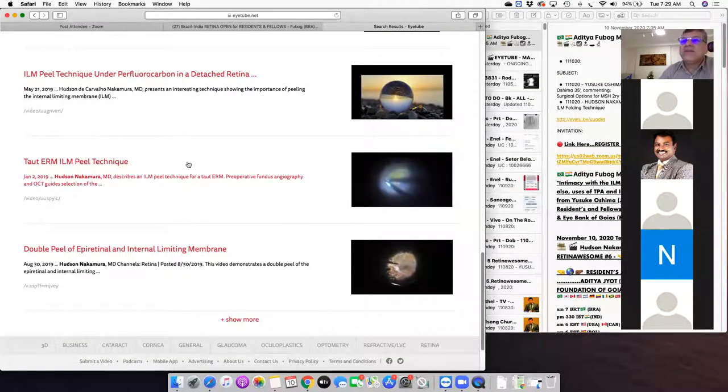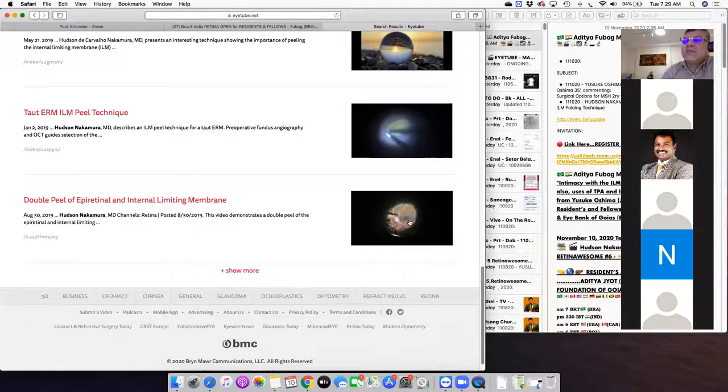If you have a very tough epiretinal membrane, how can you remove it without damaging the retina? This is another case — a double peel for diabetic patients. Some diabetic patients have had laser and have intrinsic retinal changes, so it might not be easy to get the internal limiting membrane. You've got to be very careful.